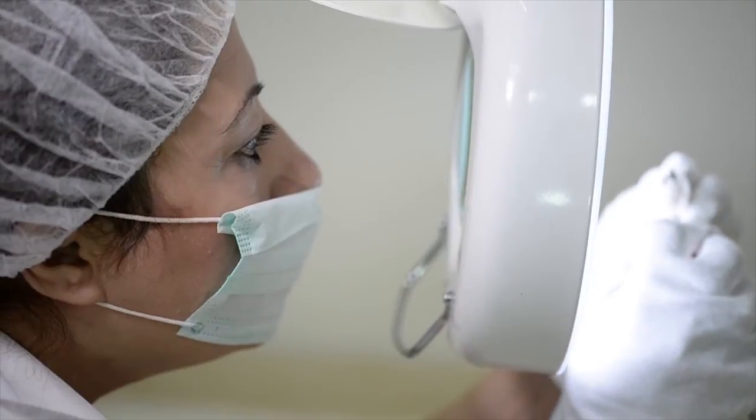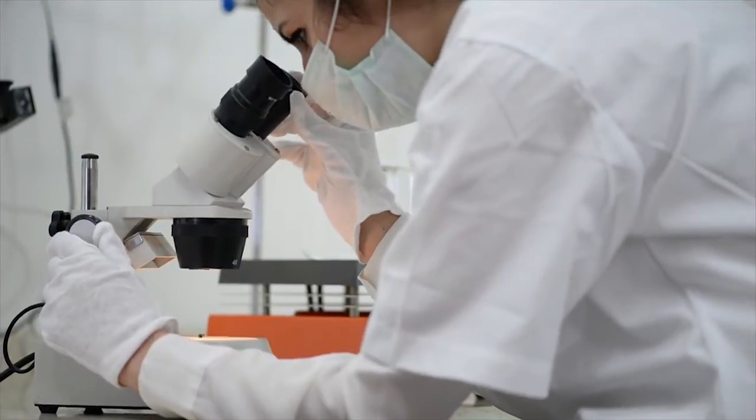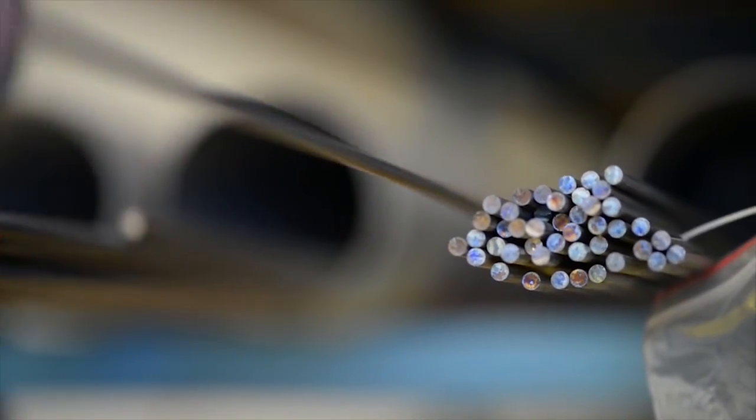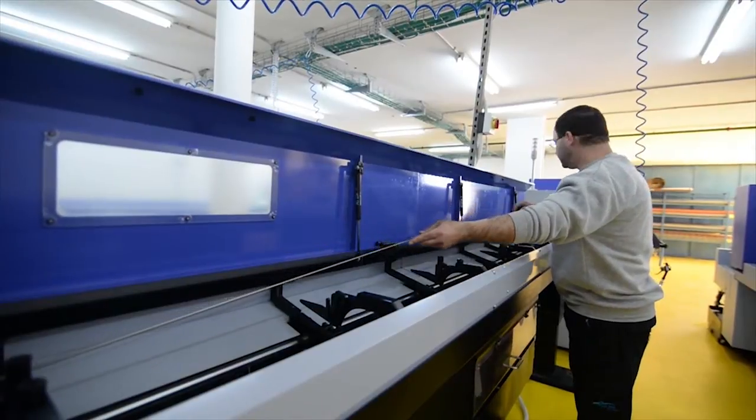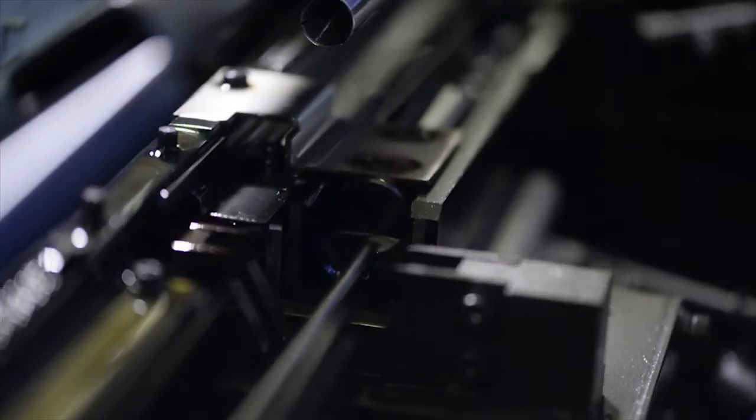Dental implant production at Alphagate starts with titanium bars that are first cut into pegs of various lengths.